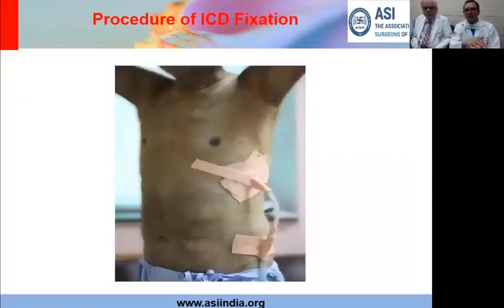Now another important thing which we have learned along the way is that many times people used to have just this dressing and this tube hanging down connected to the bottle. Many times during shifting, there is a pull that causes pain to the patient, and sometimes there could be inadvertent pulling out of the tube. So now we've started what we call secondary strapping, where we give a little loop of chest tube here and then another area where Dynaplast or plaster or something fixes it.